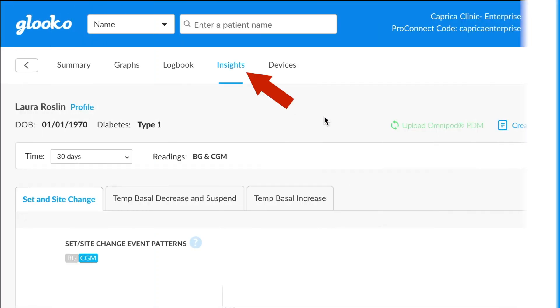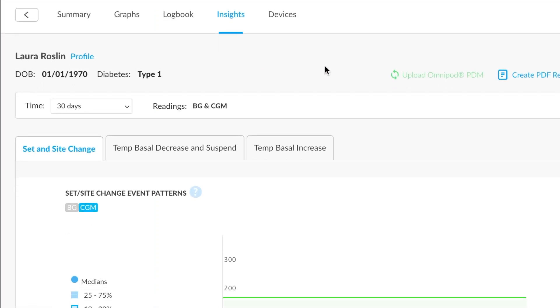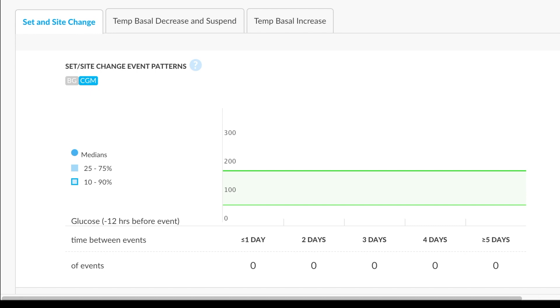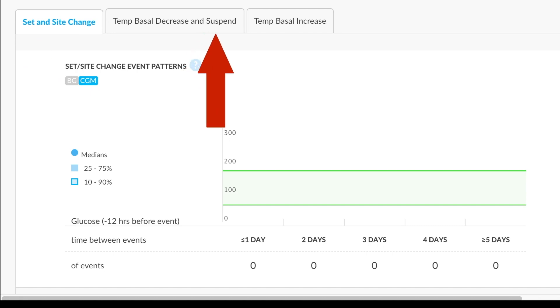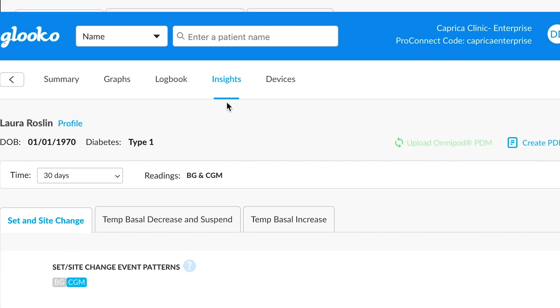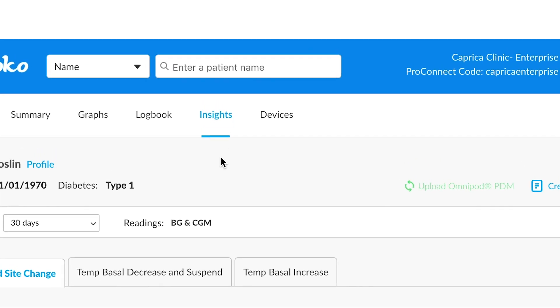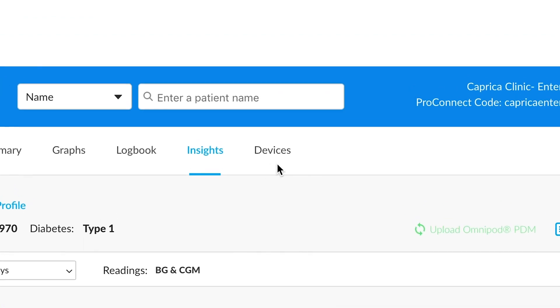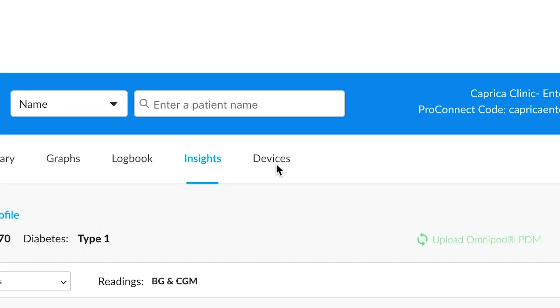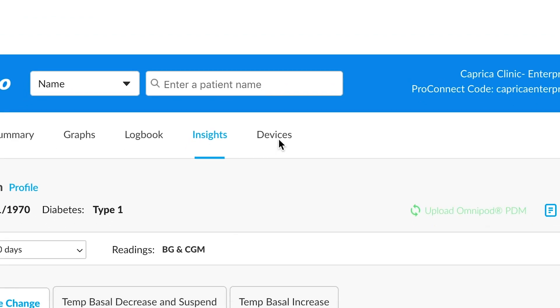Insights is a place where we can view trends in common pump events like site changes and temp basal. And last but not least, another handy feature is this devices section.